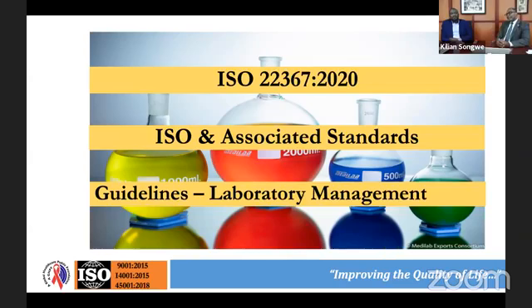And just if you want to piggyback again some more, at the beginning, we spoke about the sigmoid curves and all of those kinds of things. When you're talking about cutoffs, the big conversation today when we're talking about COVID-19 and the PCR tests is trying to figure out, in terms of verification, the manufacturer has a cutoff that they have for reading their results. In terms of validation, it is if we want to change where we want to read those results from. But again, in terms of understanding what calibration is involved, what calibrations are necessary for the pipettes and the other things that we're going to use.